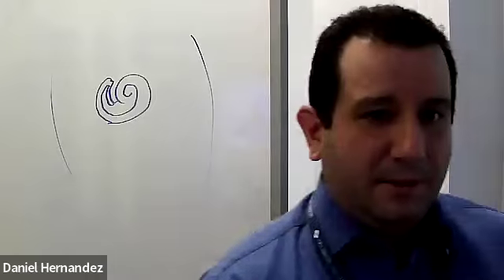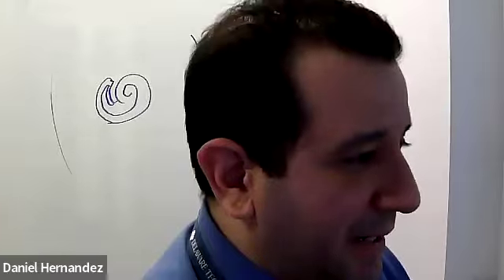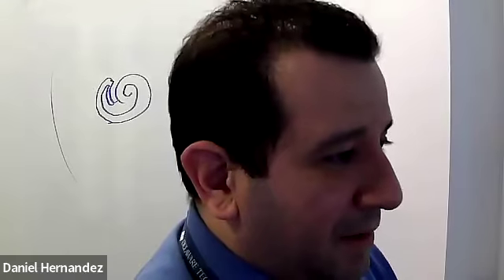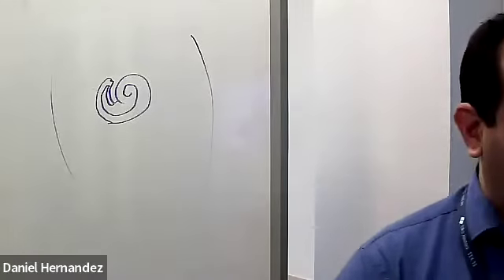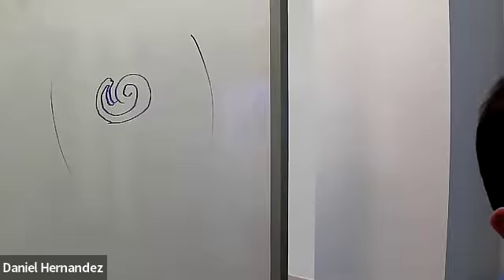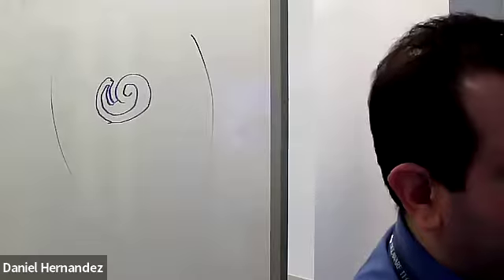So normal pylorus. This is a nice, beautiful picture here for a normal pylorus. You can see the little echogenic bubbles within it. So you've got your distal antrum over here, your pyloric channel, and then your duodenum. The duodenum almost looks to me like either a mushroom cap or a snake head almost. It creates this triangle, this V that sits over the pyloric channel. So the pyloric channel or the sphincter is just this little part right before that triangle.